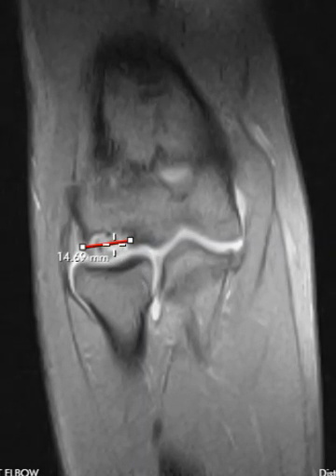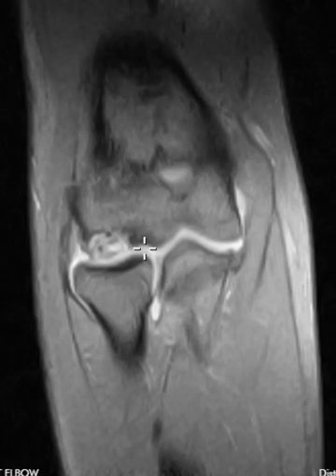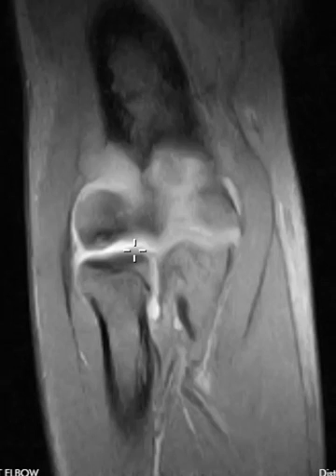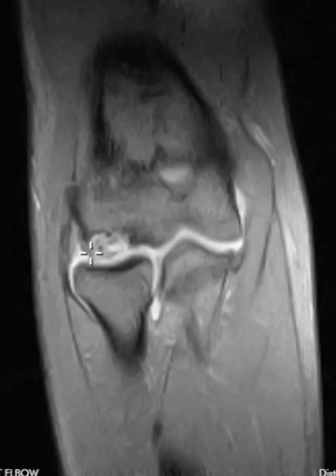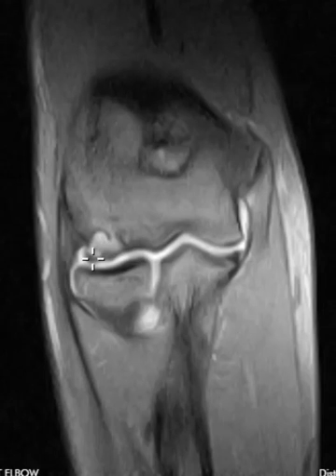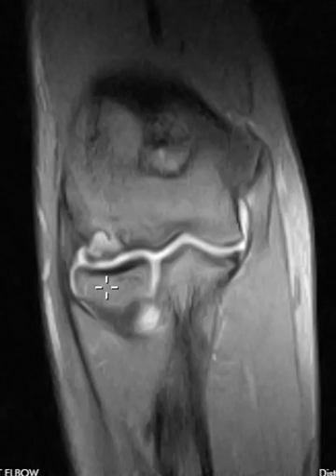When we see an OCD, we want to decide: is there loosening, is there displacement? That's what the surgeons want to know. If there's no loosening or undermining of fluid or displacement, they may be able to treat it conservatively, but if not, then they have to go in and drill it. In this case, we see that there's an awful lot of fluid going underneath it — so this is definitely loose — and we also see this linear band here. This is a fragment that is displaced, so this is a displaced osteochondral fragment.